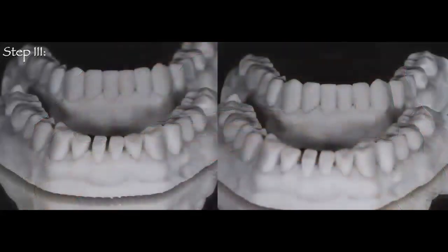So once I have this scan, I go ahead and submit it to my dental laboratory. What I'm going to ask them to do is to wax up digitally a new curve of occlusion going from canine to canine on the mandibular arch. And once those mandibular teeth are waxed up digitally, then to add any wax needed on the lingual surfaces of the maxillary incisors and canines to recreate a new envelope of function with these mandibular incisors completely restored.